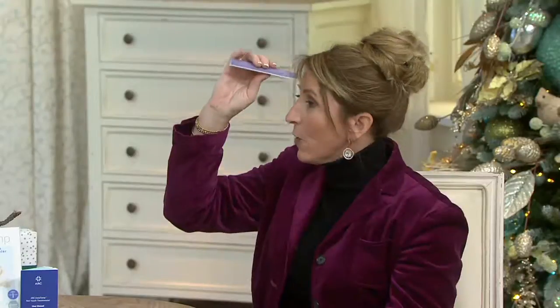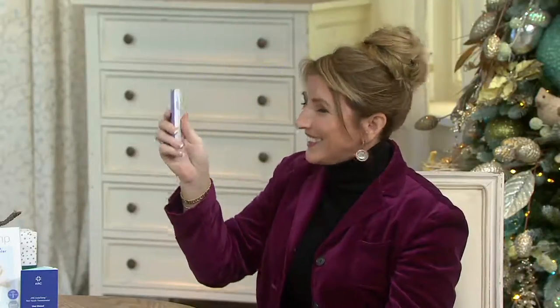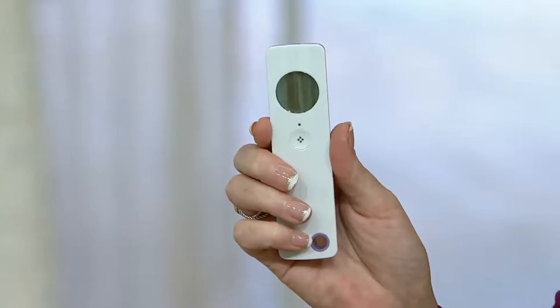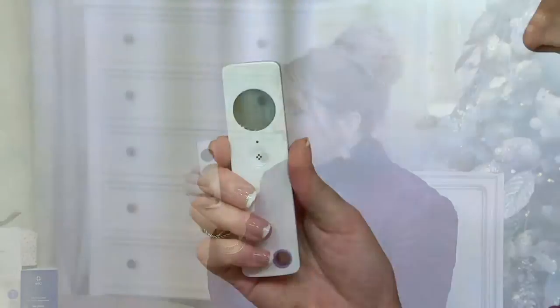It's always accurate and you're going to get over 7,500 readings, so it's going to last a lifetime of the product. And this is a medical device — this isn't made in a factory where they make flashlights and keychains. This is made in a medical device company in Europe, so it's clinically accurate. Your temperature is 97.9. And even if you don't read the number, you have the color indicator.